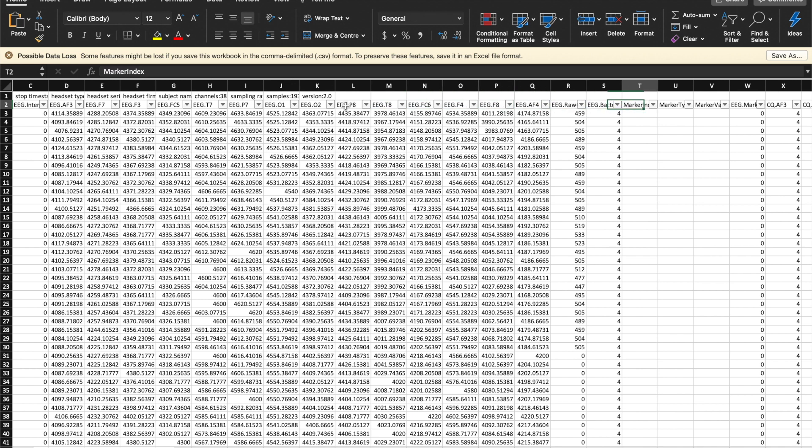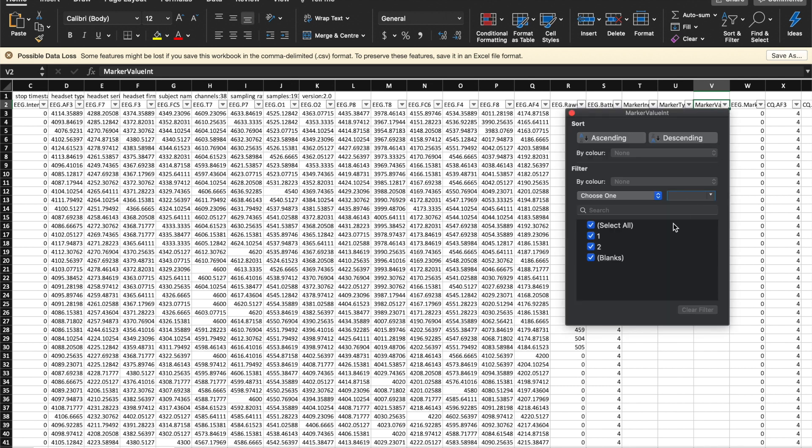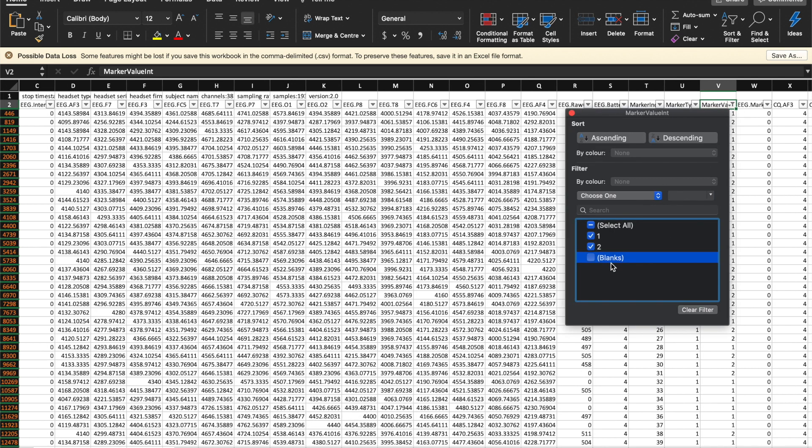The markers that we entered are in the column titled MarkerValueInt. If we filter the blank rows from this column, you can see that approximately 20% are 2 and the rest are 1.